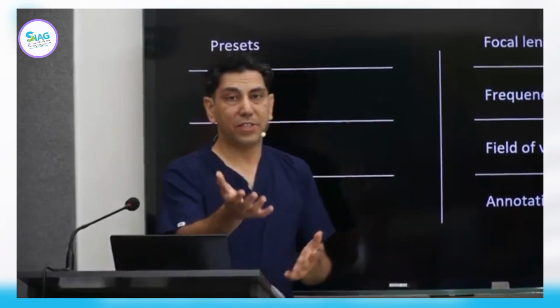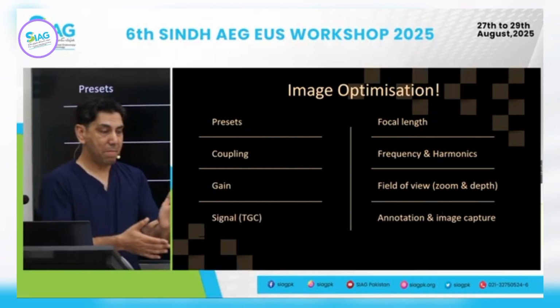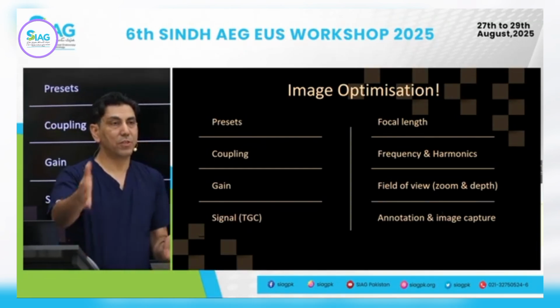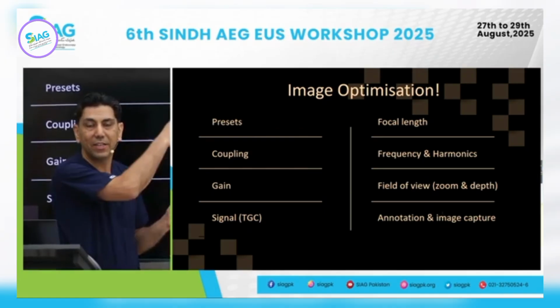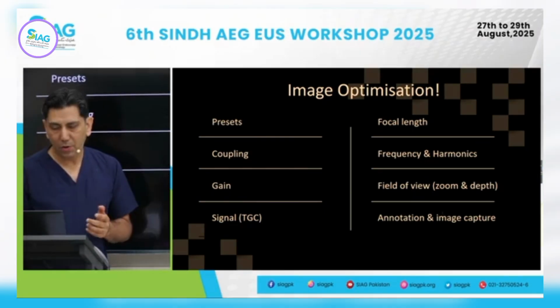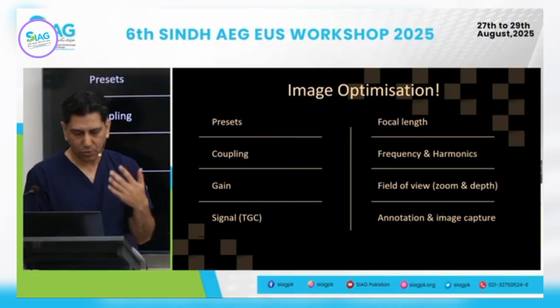As I mentioned, if it's a case you've seen earlier, a replaced right hepatic artery, this patient's decision may have consequences for the surgeon. You want to then highlight that this patient has a replaced right hepatic artery and that's where it is. So that's how it helps you in getting there. So I thought it was important for us to discuss it.